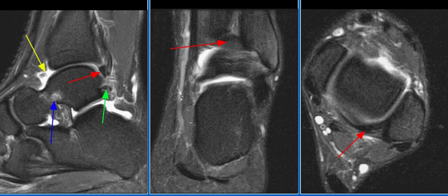A 27-year-old female dancer with a history of left ankle pain underwent MRI examination of the left ankle. The transverse ligament is hypertrophied, forming a posterior labrum, as seen on this image with the red arrow. There is moderate fraying of the posterior talofibular ligament.